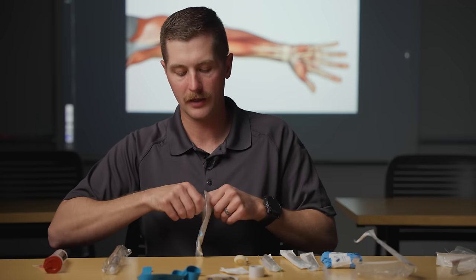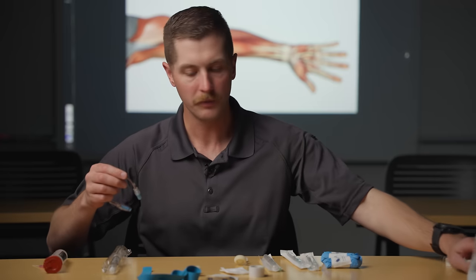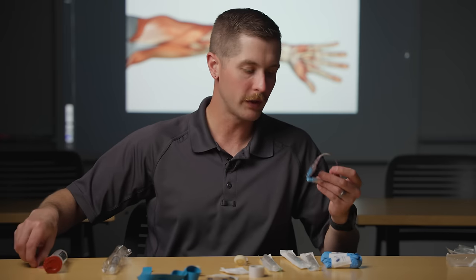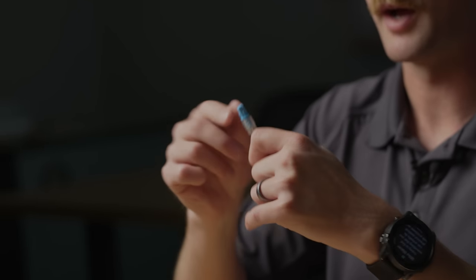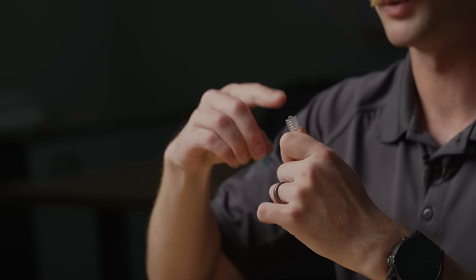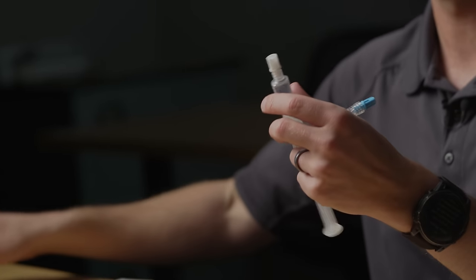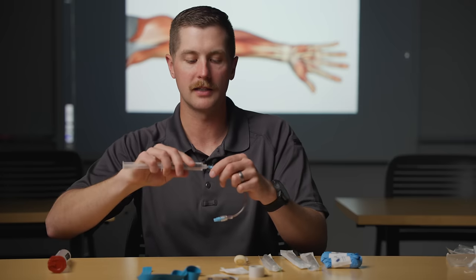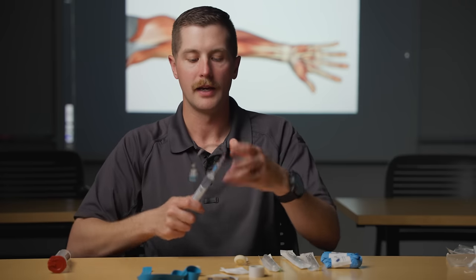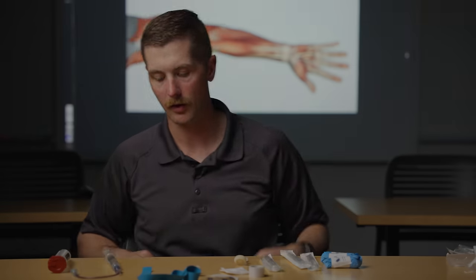We've got the J-loop and an IV flush. On these devices, the only thing that is sterile is going to be the end with the blue cap. If I take this off, this is supposed to be a sterile field — we don't want to touch that or let it touch the ground. Then we've got the flush: same thing — if I remove this cap I don't want to touch there. I'm going to connect it to the luer lock and flush it through just enough for the water to come out.